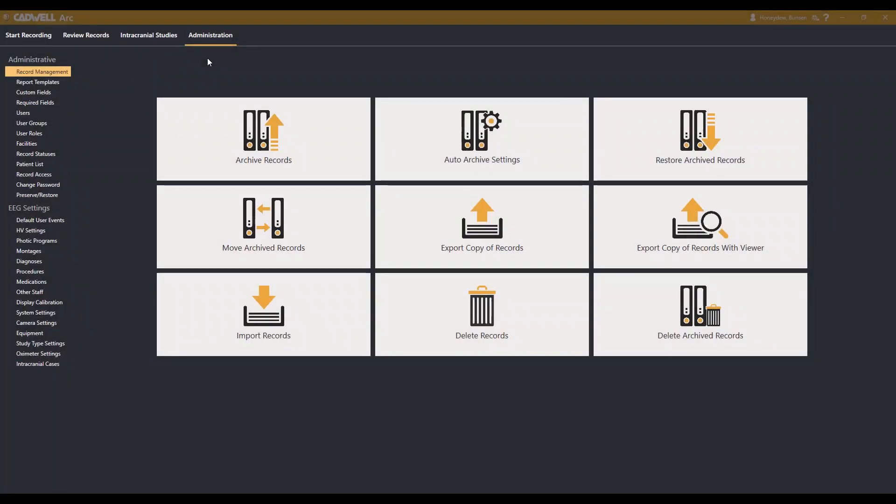In this video, we will show you how to restore EEG records from archiving. From the Administration tab, select Record Management from the left of the screen.